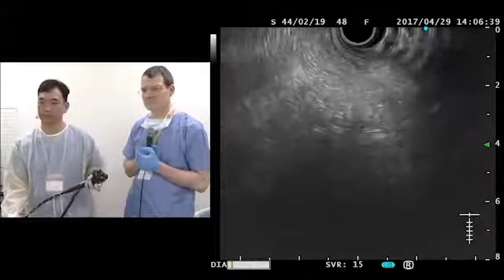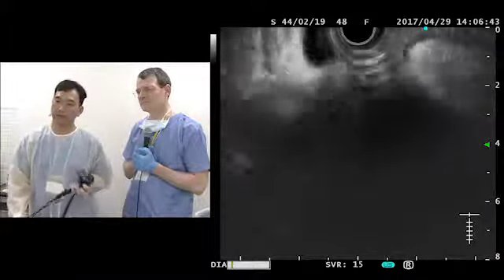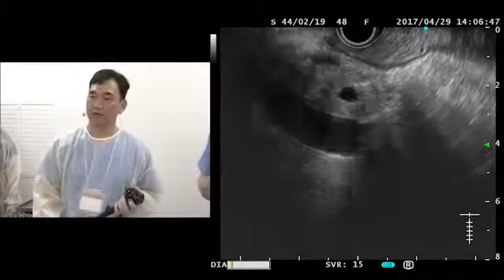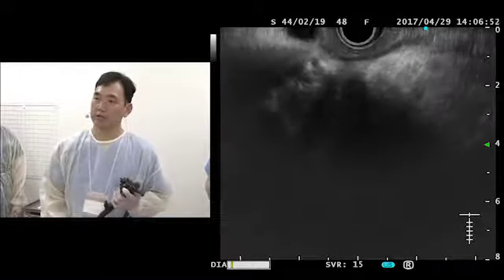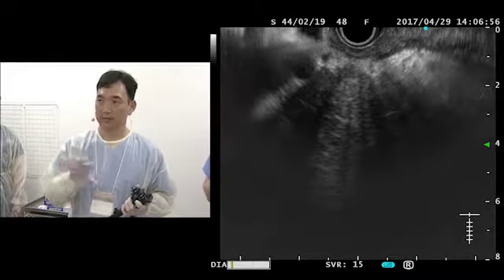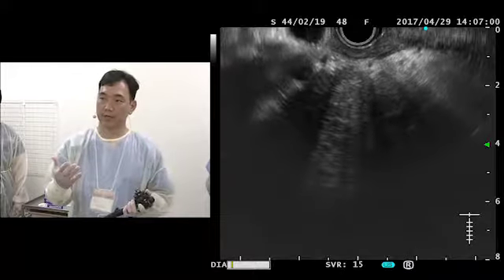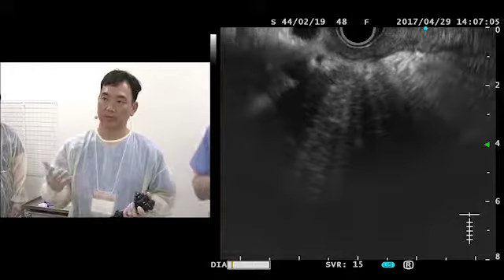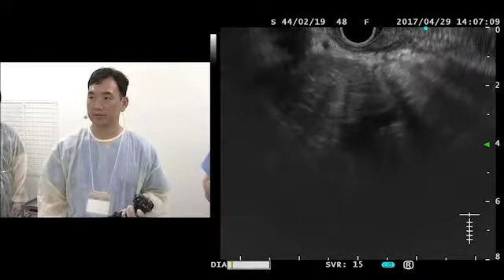If you see any transition zone at the pancreatic duct, are you going to proceed with FNA? Yes. So if I cannot confirm the duct penetrating sign, then I think we have to investigate with FNA. Okay. The image negative for mass lesion does not exclude pancreas cancer. On a contrast CT scan, isodense pancreas cancer can be present about 10% of the time. So ductal change is much more important than just seeing the mass.